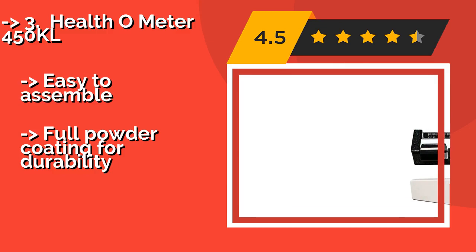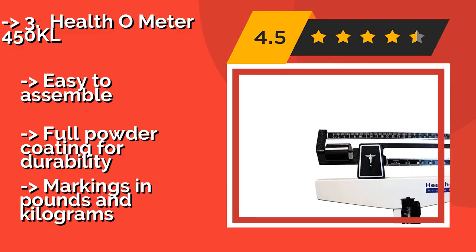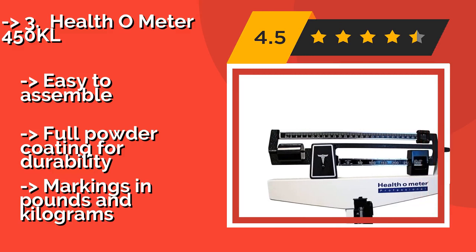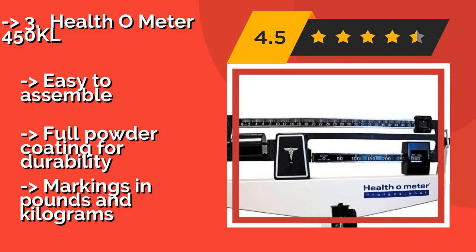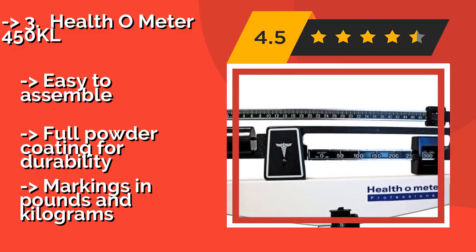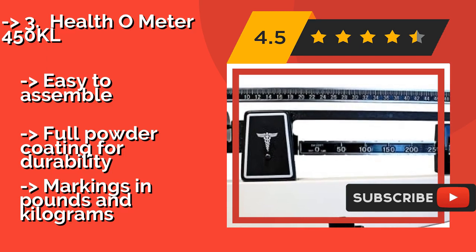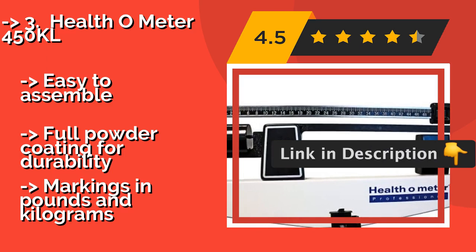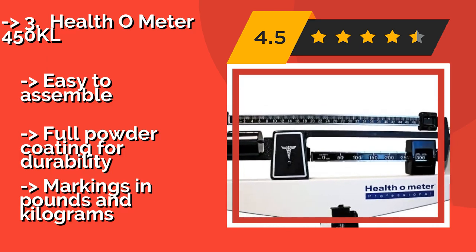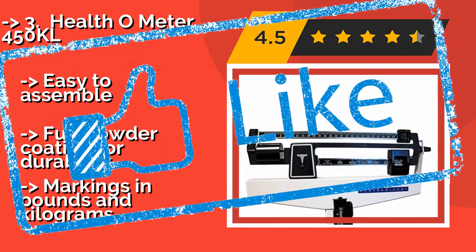The Healthometer 450, approximately $257, is on the pricier side, but it is a trusted choice that comes fully factory calibrated, so you know its readings are accurate. It has a 500-pound capacity and boldly engraved numerals that are easy to read at a glance. It is easy to assemble, features full powder coating for durability, and displays markings in both pounds and kilograms.